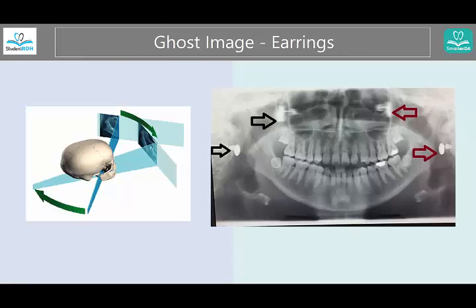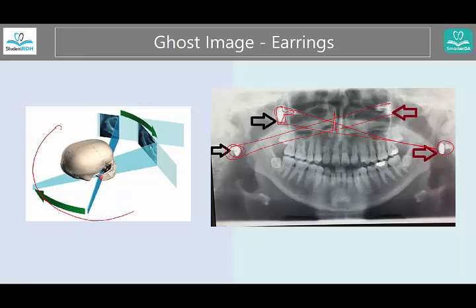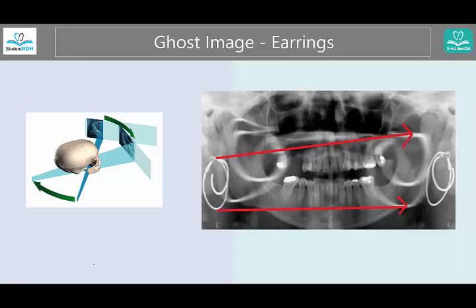Now let's look at earrings, which are the most popular example in examinations. These two are the original earrings. This one is reflected as a ghost image over here — you can see it's bigger, has exactly the same shape but is more blurry. And this one is reflected over here as well, with the tube rotating behind and the film receptor in the front.